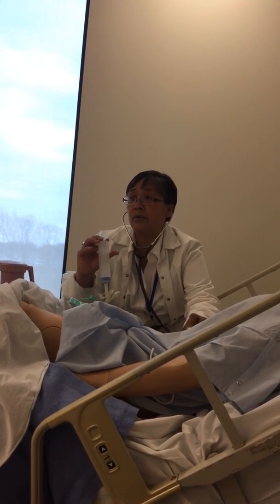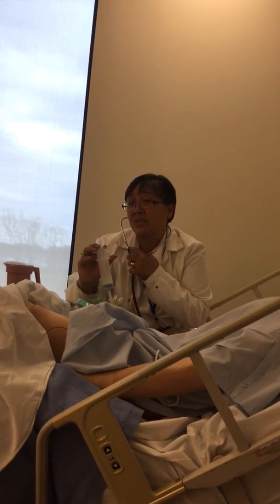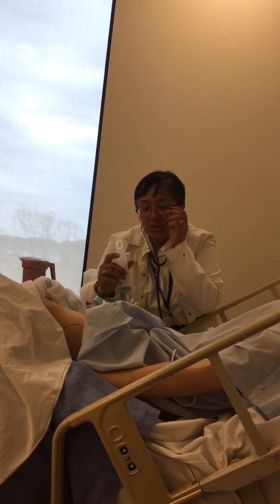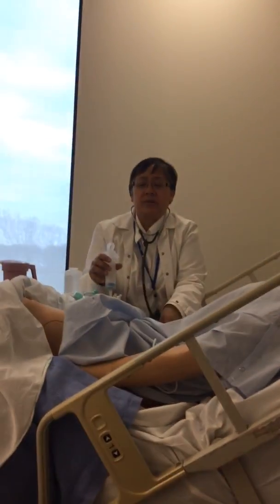Okay, what I should be hearing is a swoosh, showing that it's actually in the stomach. There's no other place where it would be, right? If it was out, it would be obviously out. But I guess we're just doing this all the time as assurance that it's in the right place.